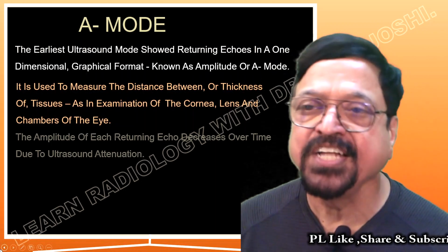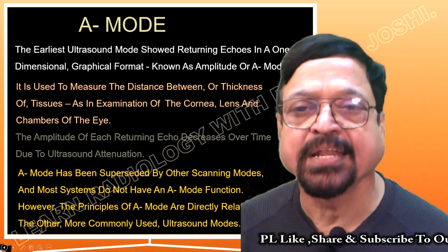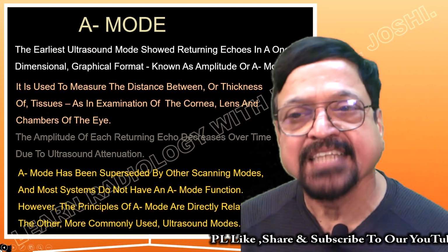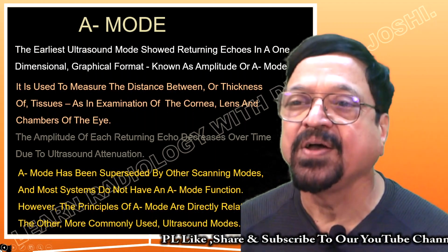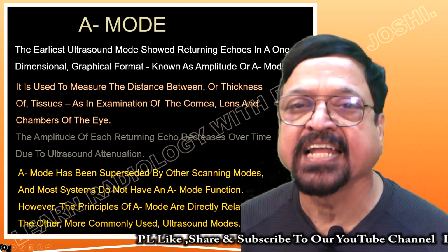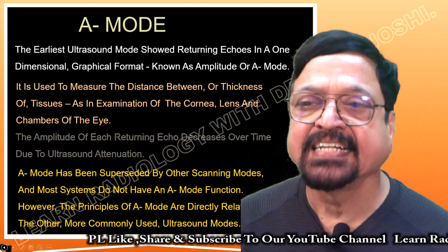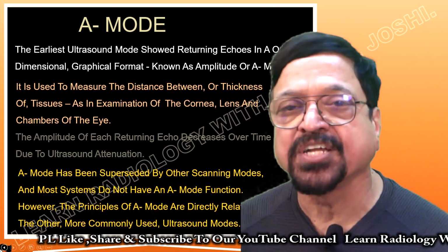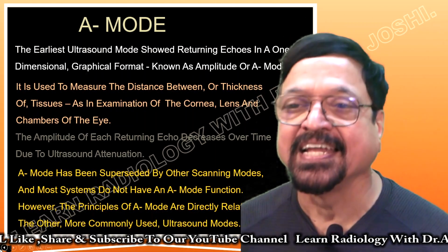The amplitude of each returning echo decreases over time due to ultrasound attenuation. A mode has today been surpassed by another scanning mode, and most systems do not have an A mode function on their scanner. However, the principles of A mode are directly related to the others, meaning those who are using some mode which is not A mode, but the principle is related to it.